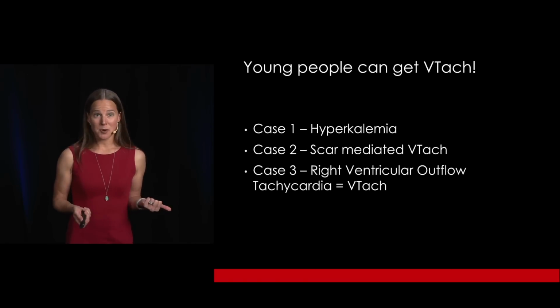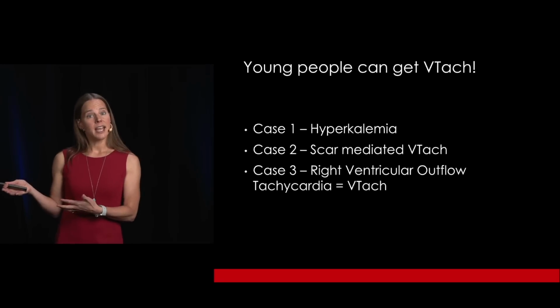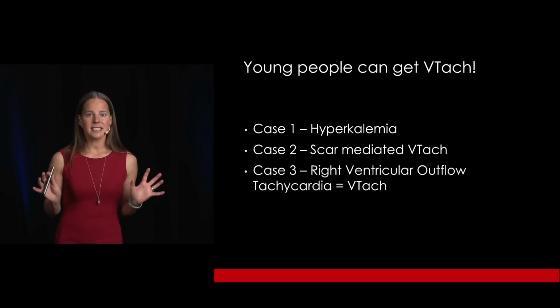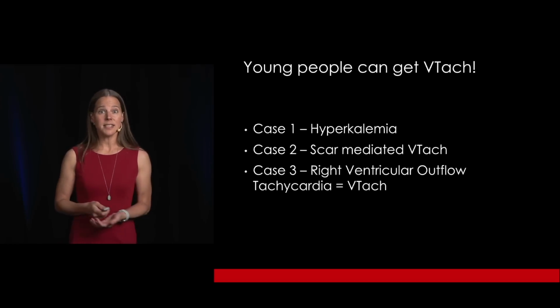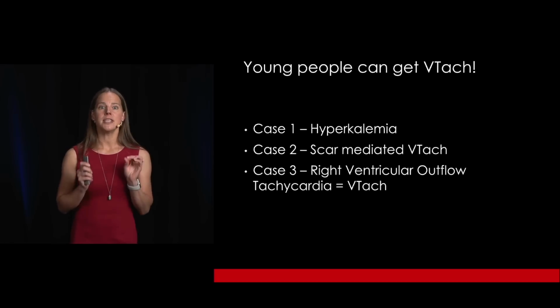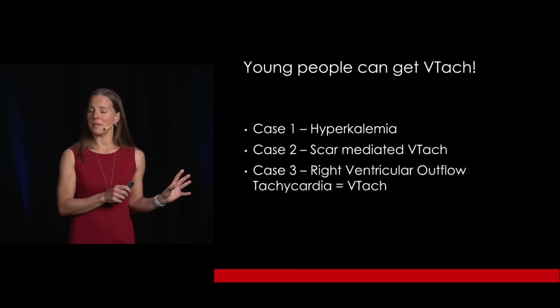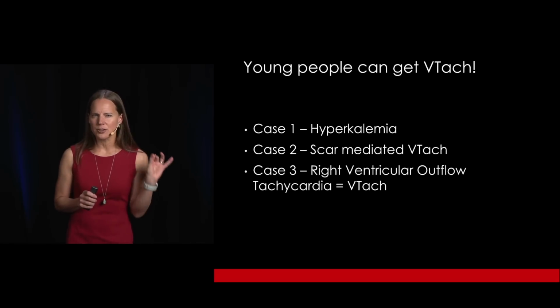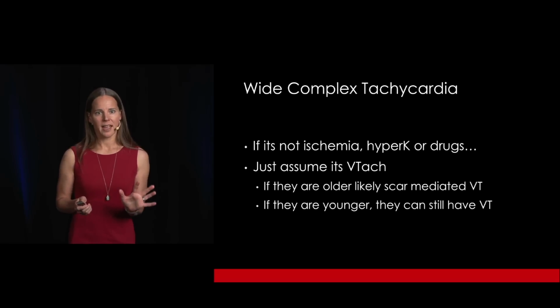So case 1 was hyperkalemia, treat appropriately. Case 2, ischemic VTAC, treat appropriately. And then case 3, even though the patient was 20 years old, this is called right ventricular outflow tachycardia, which is a kind of VTAC. So remember, young people can get VTAC. So again, back to our main point, if you don't know what it is and it's not hyperkalemia, ischemia, or drugs, just assume that it's VTAC. Okay.